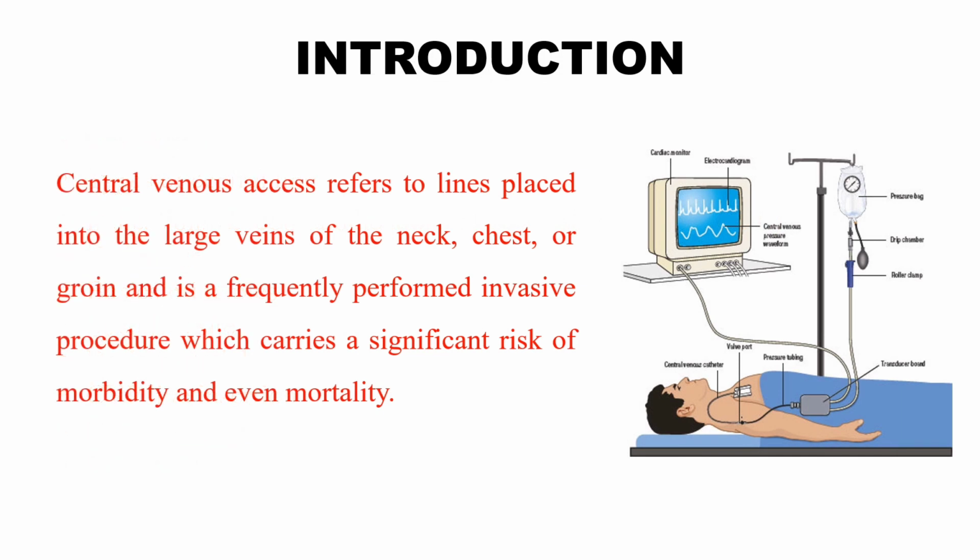Introduction. Central venous access refers to line placement into the large vein of the neck, chest or groin, and it is a frequently performed invasive procedure which carries a significant risk of morbidity and even mortality. So these procedures should be carried out in operating theatre or high dependency care areas and always using a fully aseptic technique.